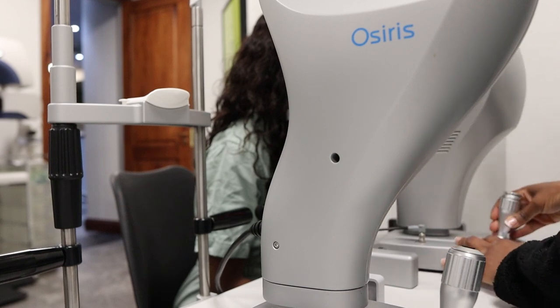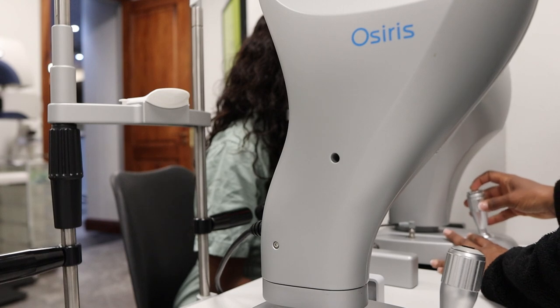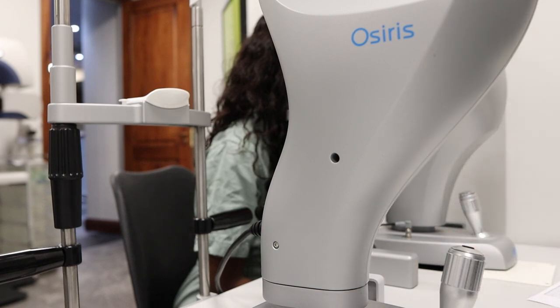You can blink. Moving to your left eye. Blink again, please. Now open as wide as possible, please. Hold it there. Wide open, wide open. You can blink. Now I'm going to check your tears to see if they're still keeping your eyes lubricated. Cool.